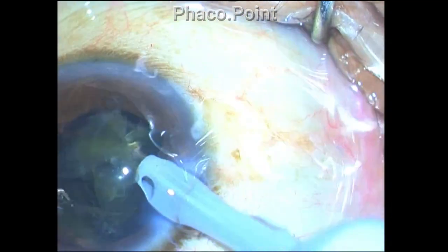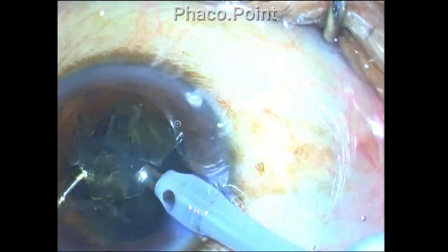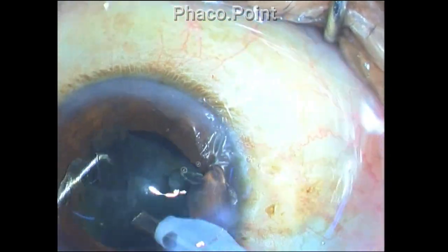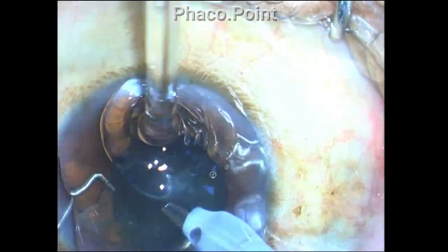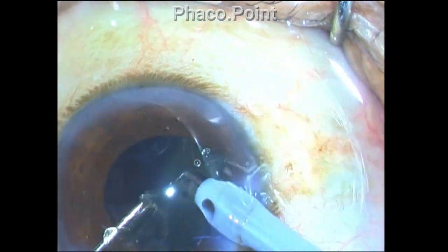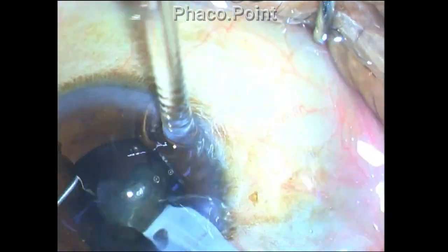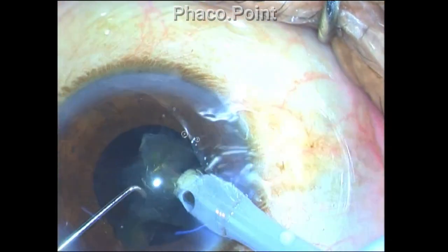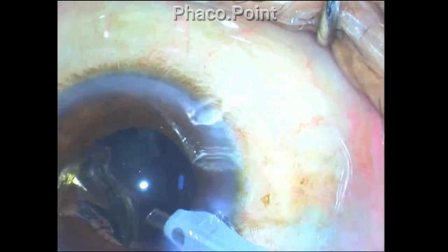The excessive movements of the phaco tip by the surgeon is not really helping in increasing the followability of the pieces. This video fits into the 'before' category — this is the way I was doing fragment removal until I stumbled upon a simple maneuver by which I can increase the followability a great deal.